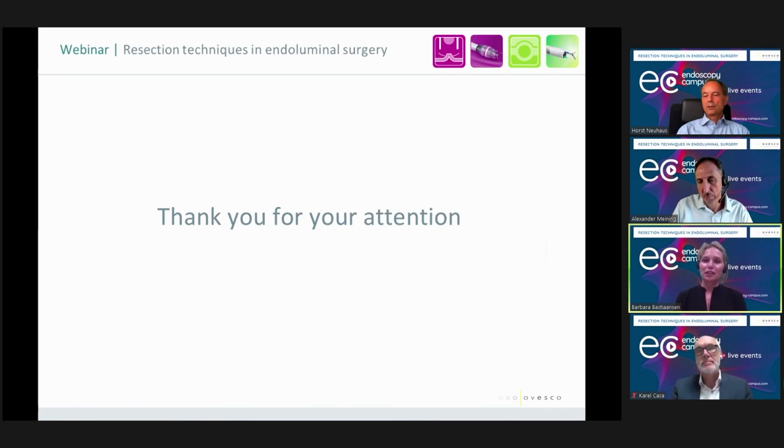This is looking in the very future, of course, but I must say that I'm interested in the hybrid approach for these laterally spreading lesions, especially in the right side of the colon, where ESD in non-Asian hands is extremely difficult. And considering also that most of the T1 cancers that we encounter have deep submucosal invasion at diagnosis.